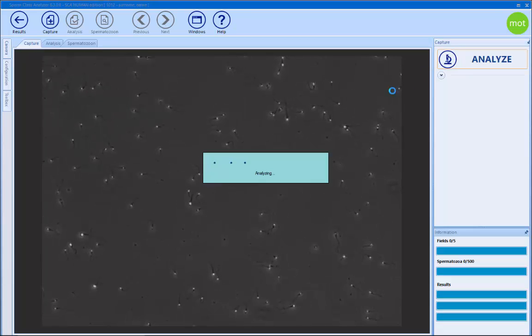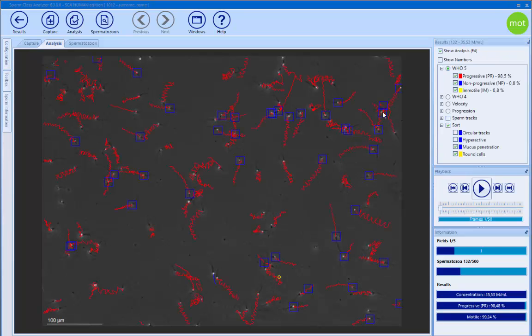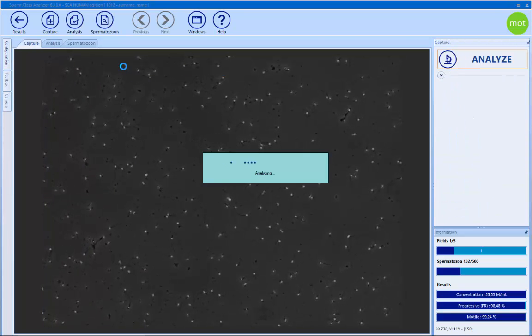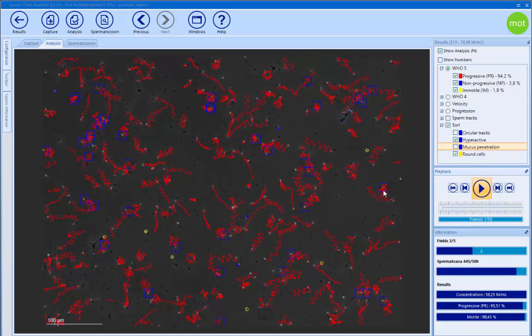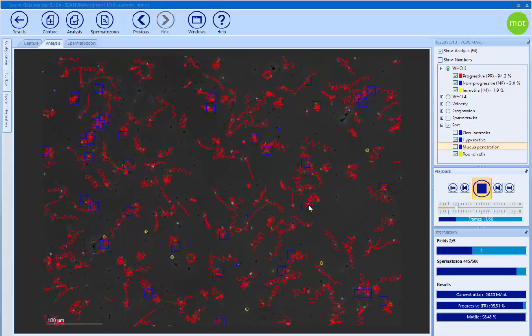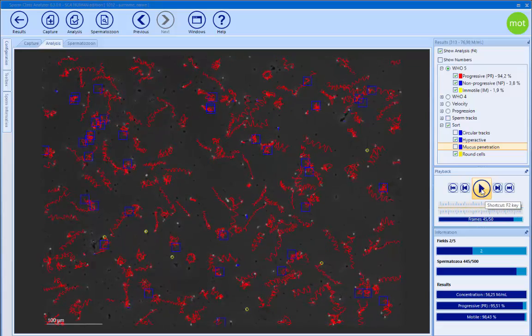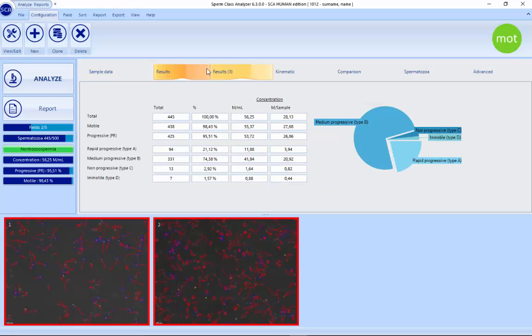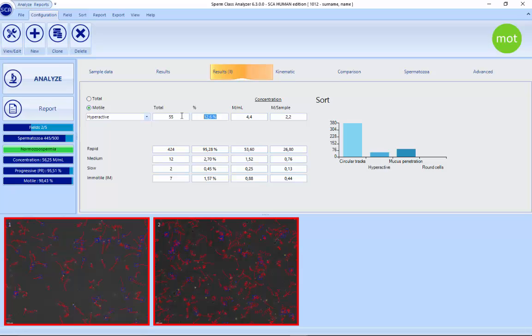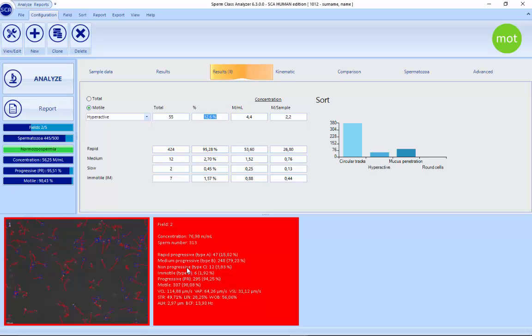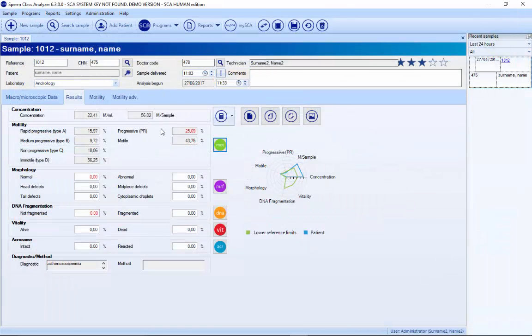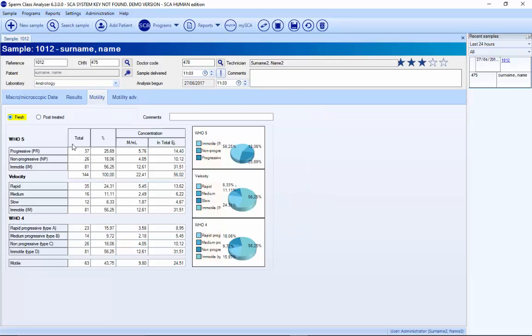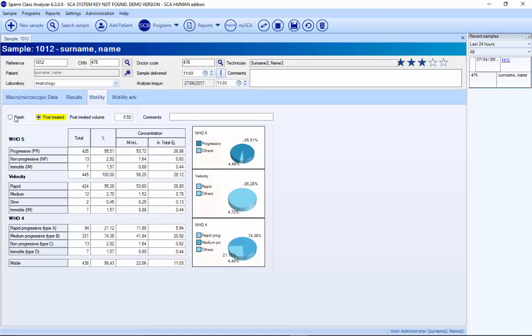We prepare the sample, put it in the microscope, press analyze, and capture each field. The good thing about the system is that it can also distinguish hyperactive sperms, giving the percentage hyperactive. Once we have both the fresh and the post-treated motility results, we can exit, and in the database of the system we will have the fresh results and the post-treated capacitation results.